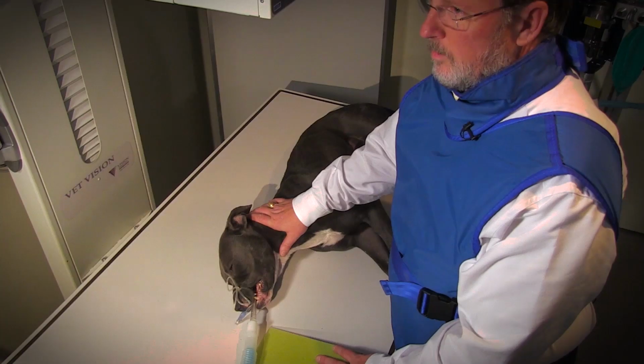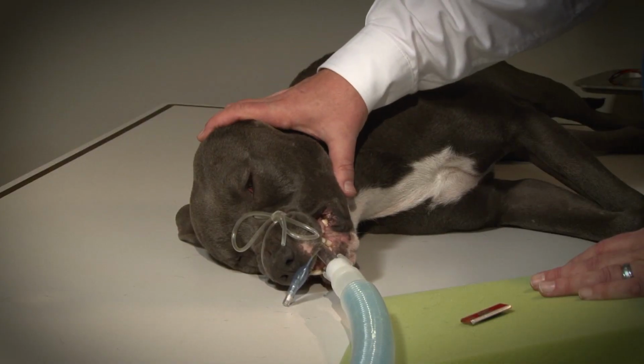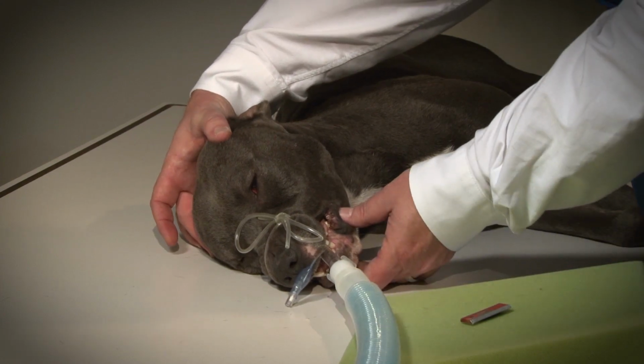So the first view that we're going to try to do is a lateral view of the skull, which sounds simple enough, but sometimes there's tips and tricks that we can use to make the image much prettier and much more diagnostic. When you look at most dogs, the way their skull is shaped, this part of the skull is much wider than down here near the mandible.